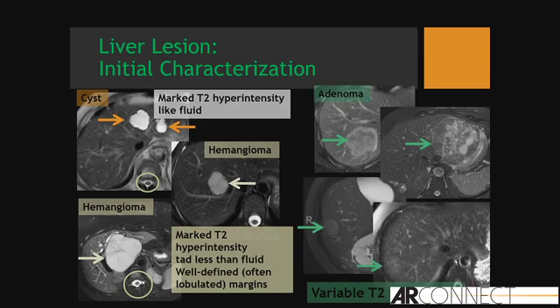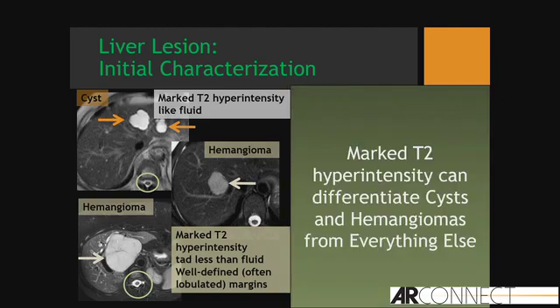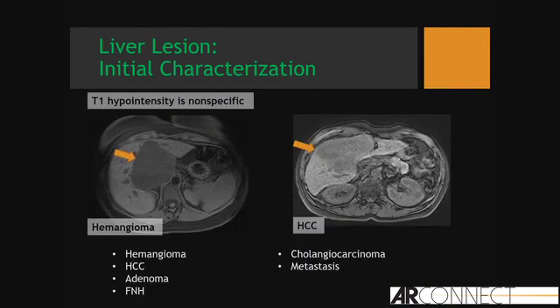It could be an adenoma. It could be hepatocellular carcinoma. It could be metastasis. It could be focal nodular hyperplasia. I can't tell you what this lesion is based on the T2 characteristics alone, unless it's markedly hyperintense, in which case I can feel comfortable saying it's a cyst. Beyond marked T2 hyperintensity, I cannot characterize lesions based on T2-weighted information alone.